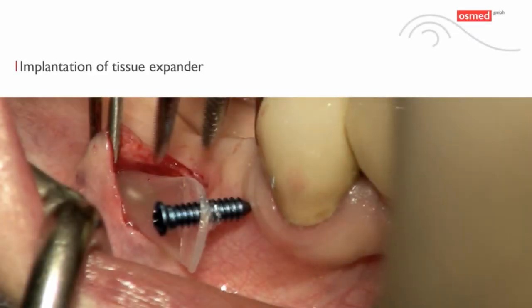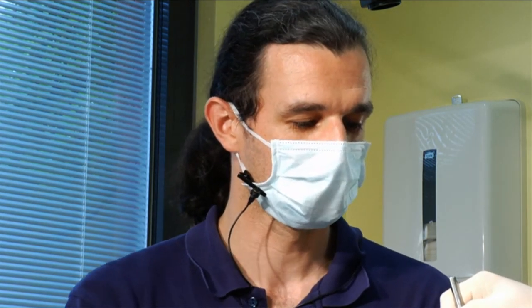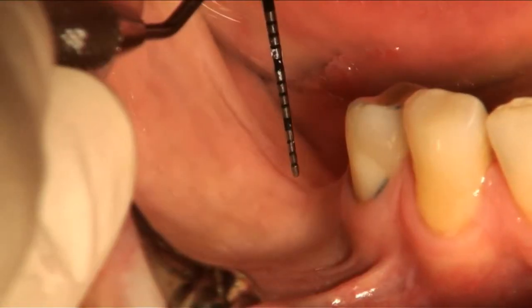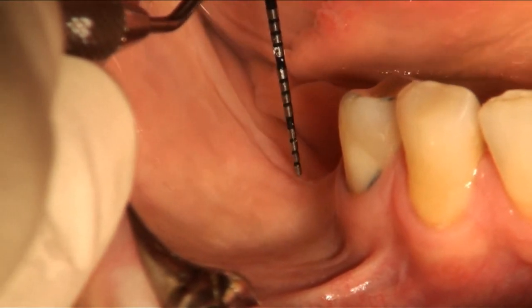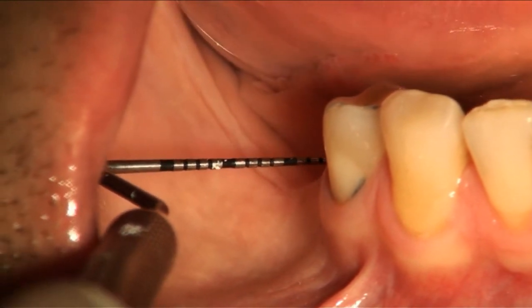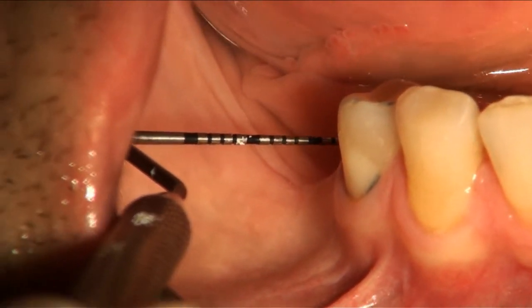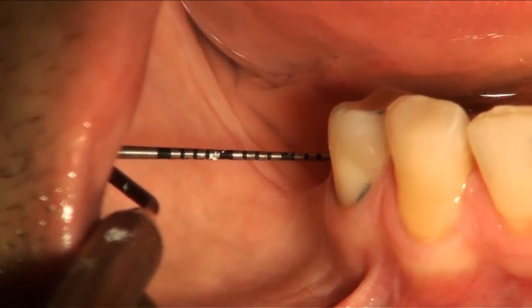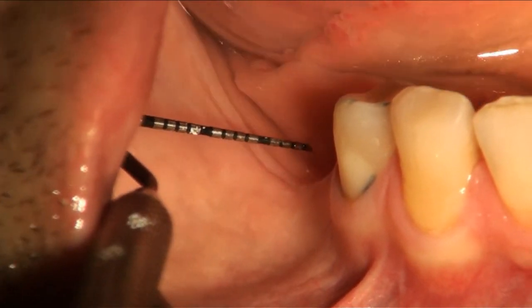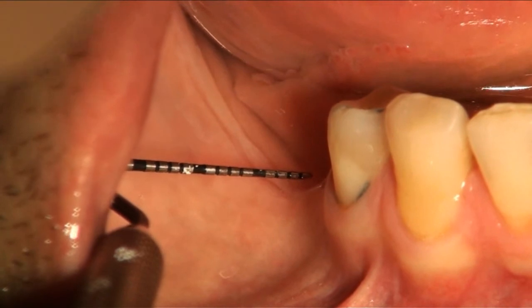Implantation of tissue expander. We plan to perform soft tissue expansion using an Osmed tissue expander before ridge reconstruction. We see a severely resorbed edentulous ridge with approximately 6 mm deficit in the vertical dimension, and of course a corresponding lateral defect. We plan to place dental implants, and as you can see by the defect configuration, it is necessary to perform lateral and vertical ridge augmentation before placement of dental implants.